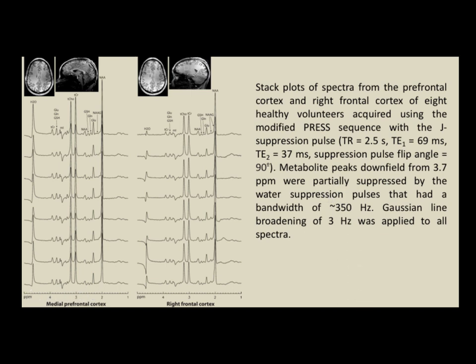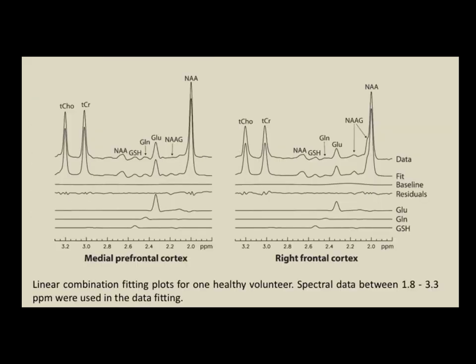So that's our first project I want to talk about. Oh, these are the fit. So still we choose one spectrum to show you the fit. That's the in vivo spectrum on top. This is the fitted spectrum. This is the baseline, then that's the difference between the in vivo spectrum and the fitted spectrum. So the difference is relatively small. It means our modeling is pretty good.